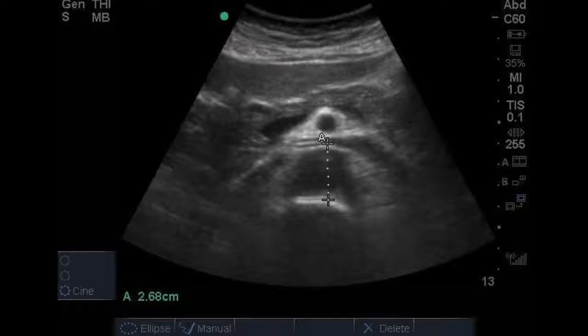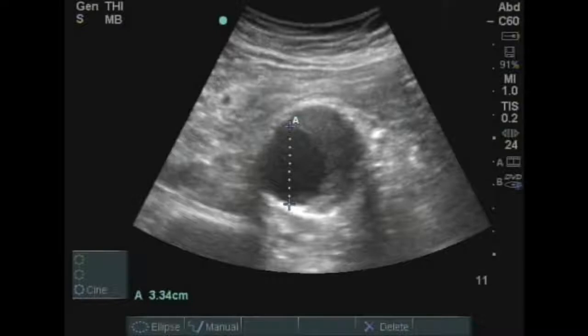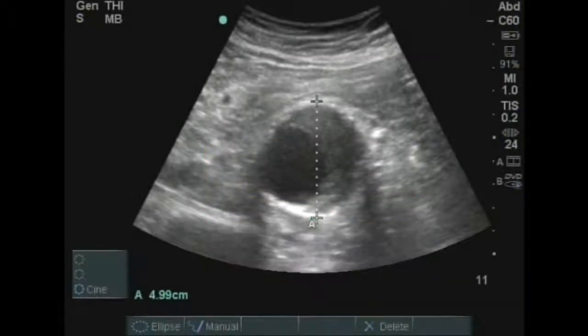Using the posterior wall to circle around to the anterior wall helps you identify the anterior wall if there are overlying structures, such as in this image with the veins and arteries nearby. When you measure the aorta, you want to include the wall. Part of this is because if there is mural hematoma in the presence of an abdominal aortic aneurysm, you don't want to just measure the lumen, such as this case, which is a failure. You want to measure the actual aortic aneurysm, which includes the outer wall to outer wall.